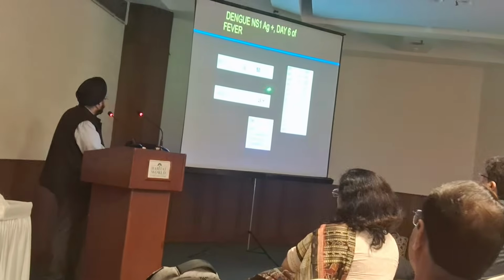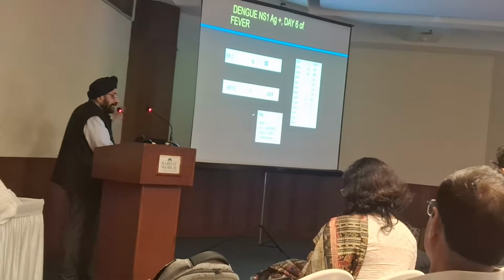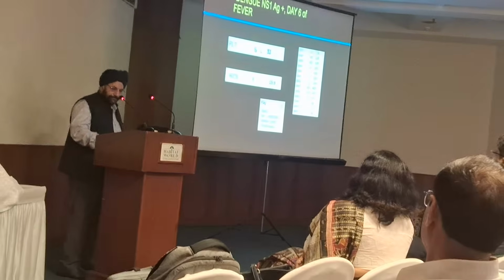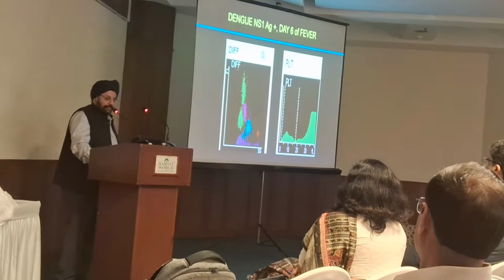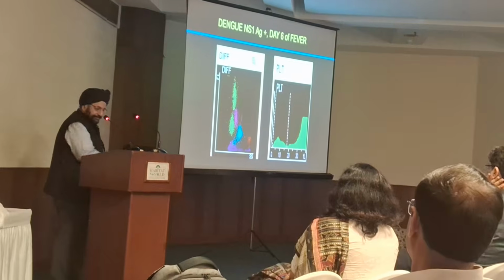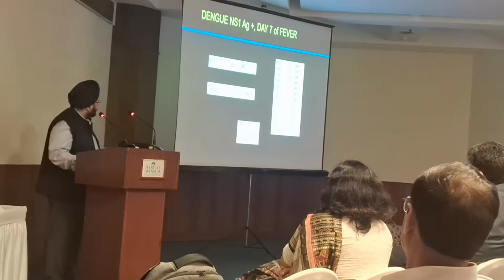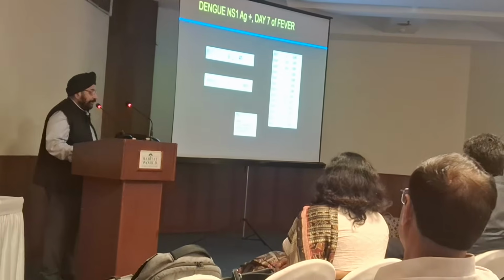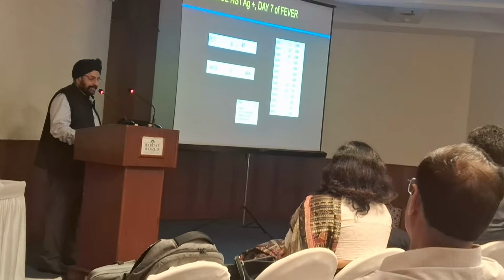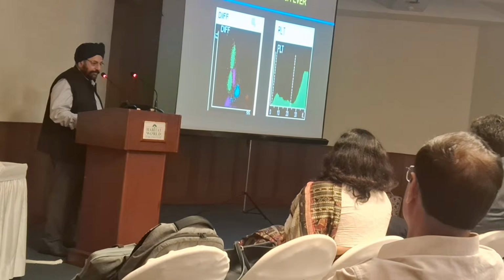Day 6, platelet count further went down to 53, HFC further increased to 15.9, but nothing like the previous time where there was a 13 times jump. This was just about a 2 times jump. Day 6, you can see the scatter plot is now more intense for the HFC. Day 7, further decrease to 41, HFC has gone up to 19.9. On day 5, we had seen that jump. So probably next day it should definitely improve. It's already plateauing. This is the scatter plot.